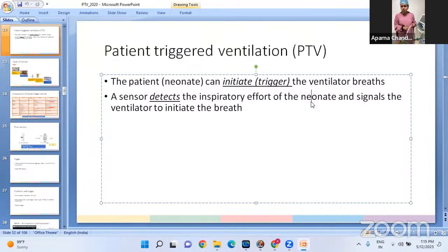Likewise, if we don't see condensation in the expiratory tubing, that is also a problem. This generally happens when there is no water at all in the humidifier chamber. So there was no water vapor picked up, and we were just giving dry and hot gases to the baby, which is also very wrong. The baby can have a lot of desiccation of the respiratory mucosa.